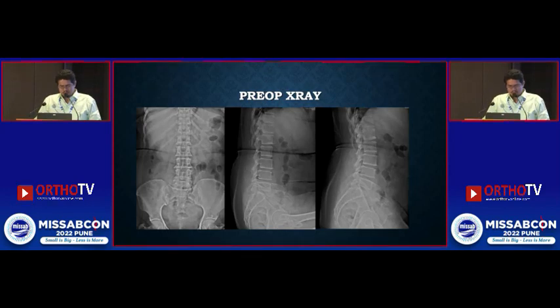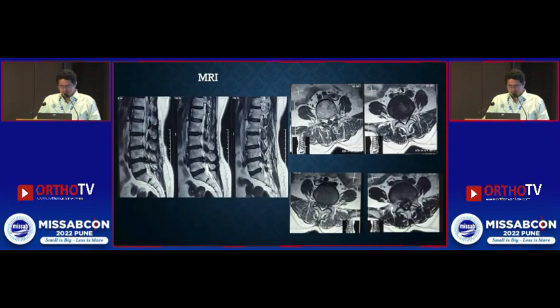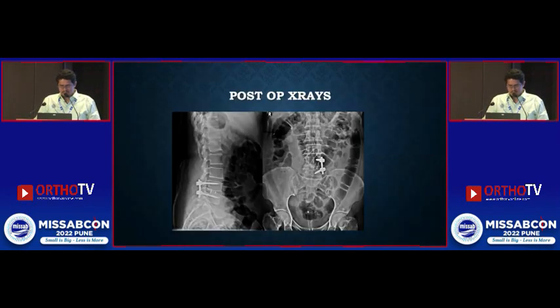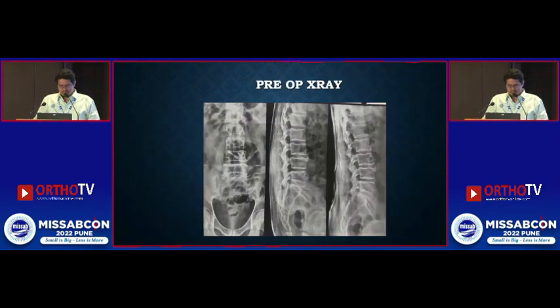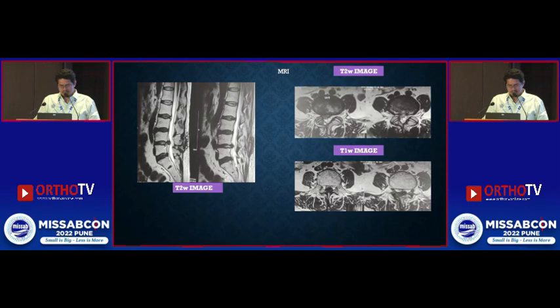We have a few cases having unilateral symptoms where unilateral TLIF was done. In the revision cases also, this is a revision case where unilateral decompression was already done.